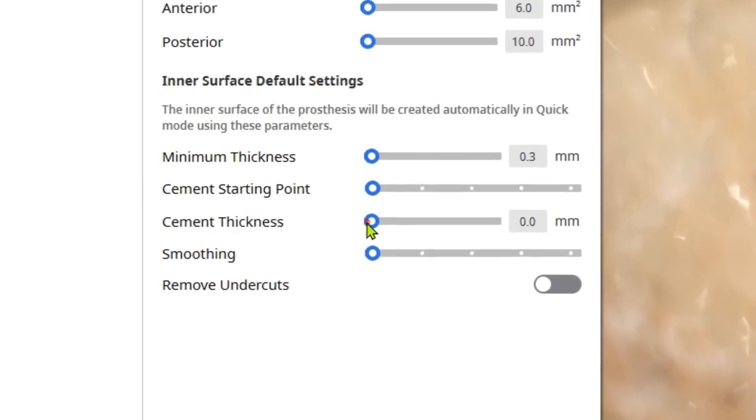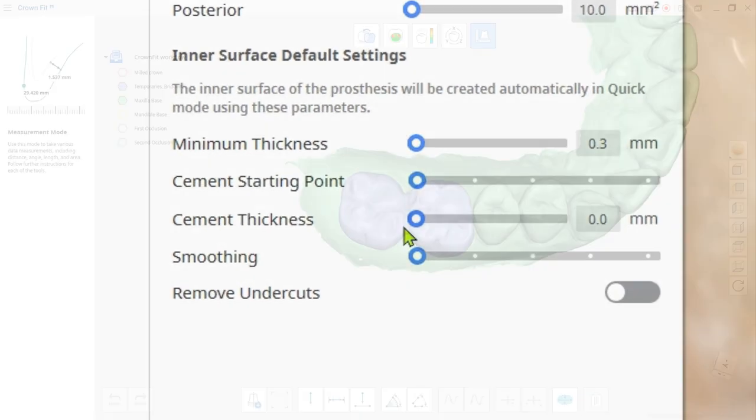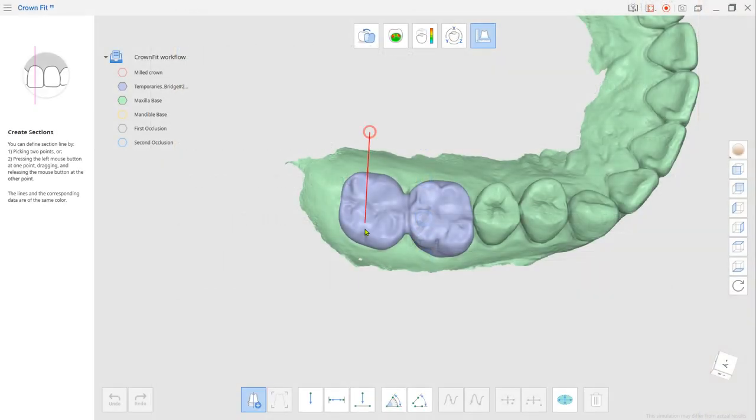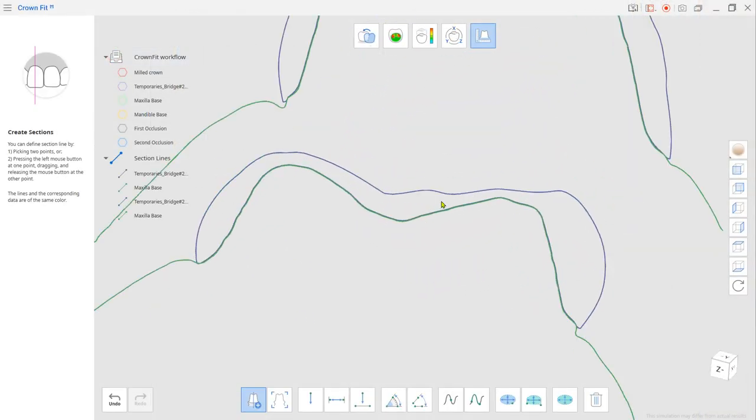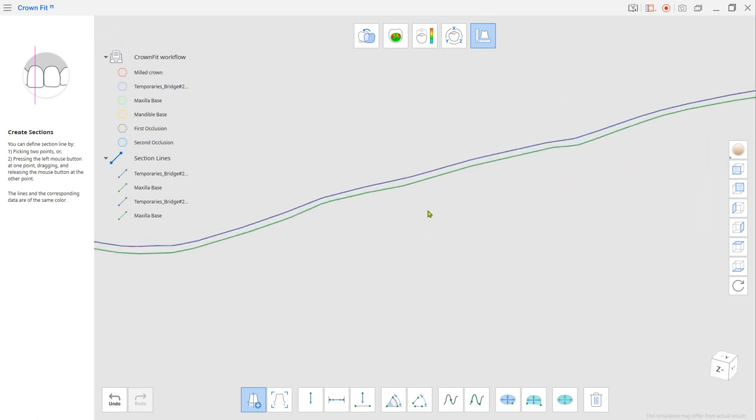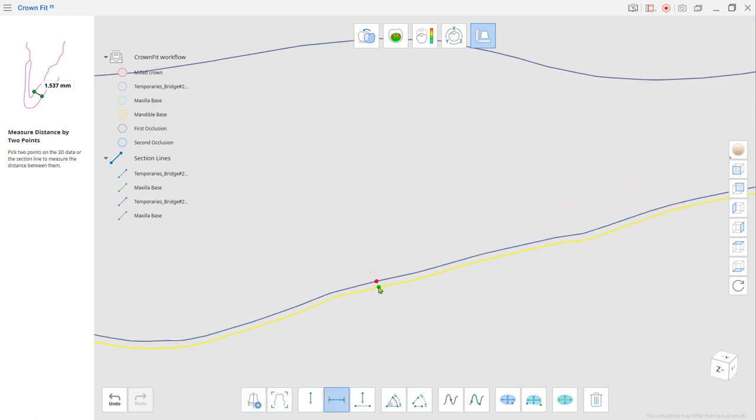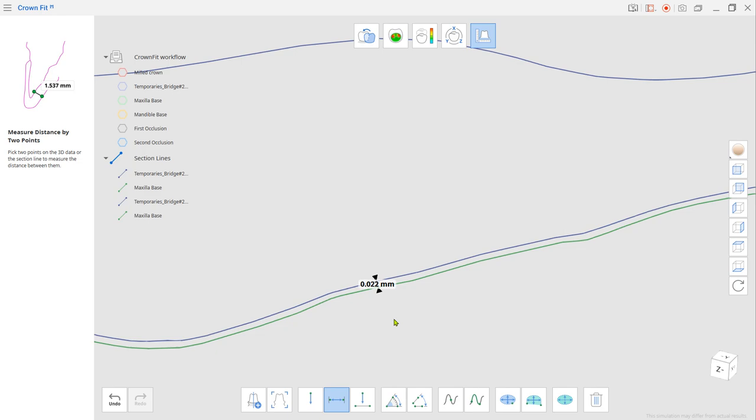Note, even though you put zero on the cement thickness, the crown still will have about 20 micrometer gap in between, which will be acceptable when checking the internal fit for most cases.